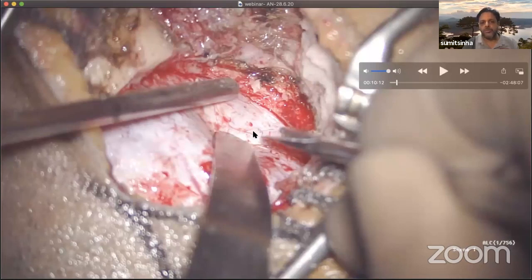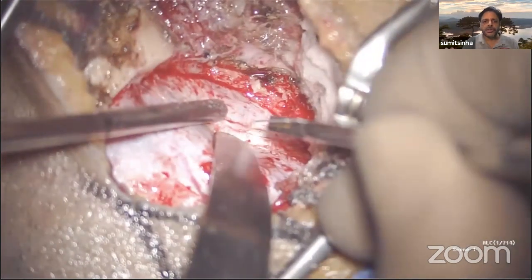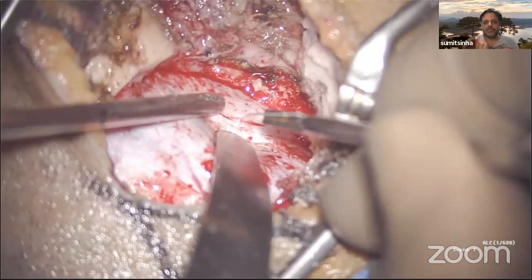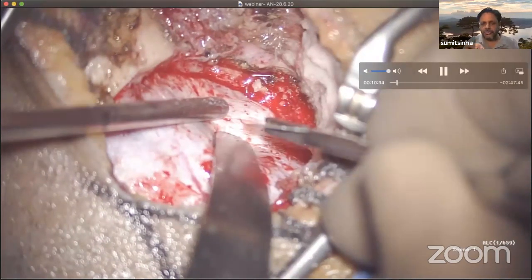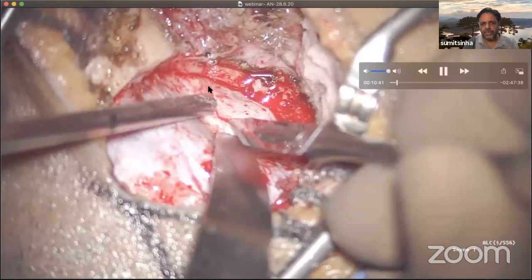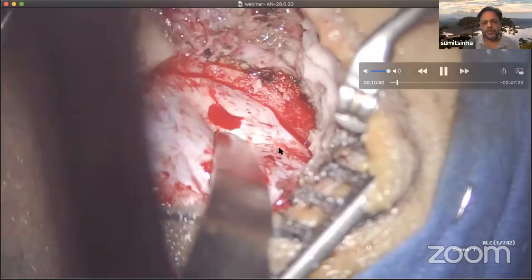What I do is open a small dura from here, as you will see shortly, and try to drain the CSF from the cerebellomedullary cistern and the cisterna magna. This is the most important procedure for the entire surgery, and it is the first step after opening the dura. Make a small durotomy. I prefer an inverted Y-shaped durotomy, a V-shape and then an extended limb from the V, so it is an inverted Y-shaped dural flap.